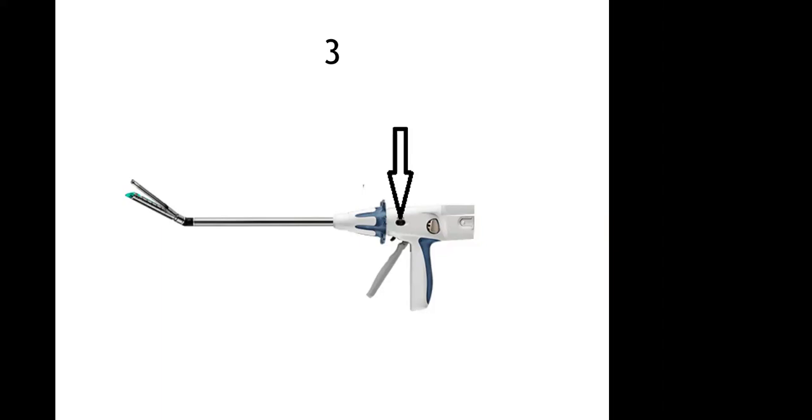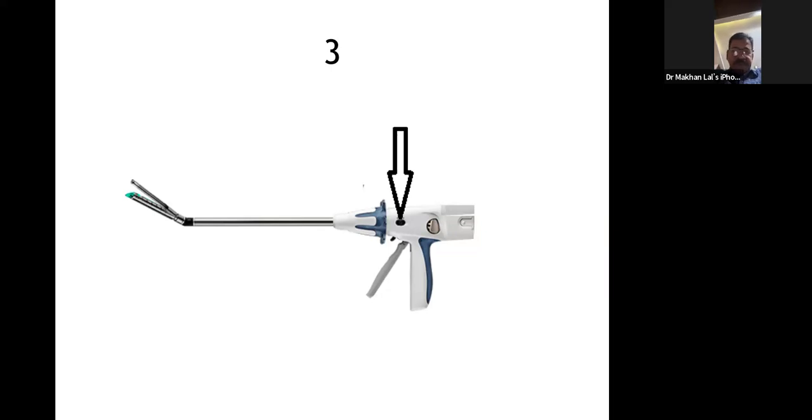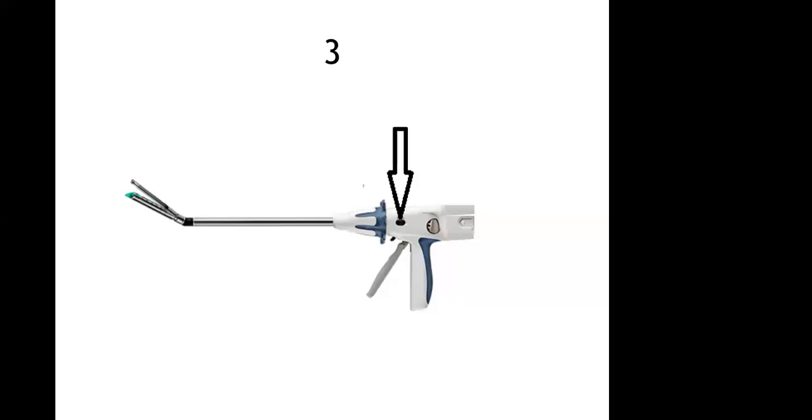Okay. What is a newer variety of this kind of stapler, where you do not have to fire after each step? Just by turning the knobs, it keeps cutting. Have you heard of the power stapler? Yes, sir. Name some operations where a power stapler is absolutely mandatory, where you have to cut a very long length.